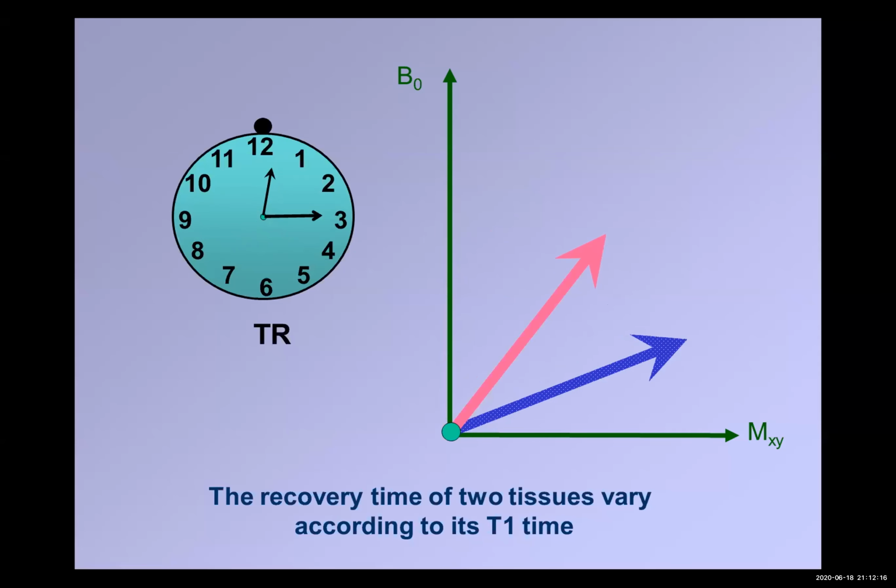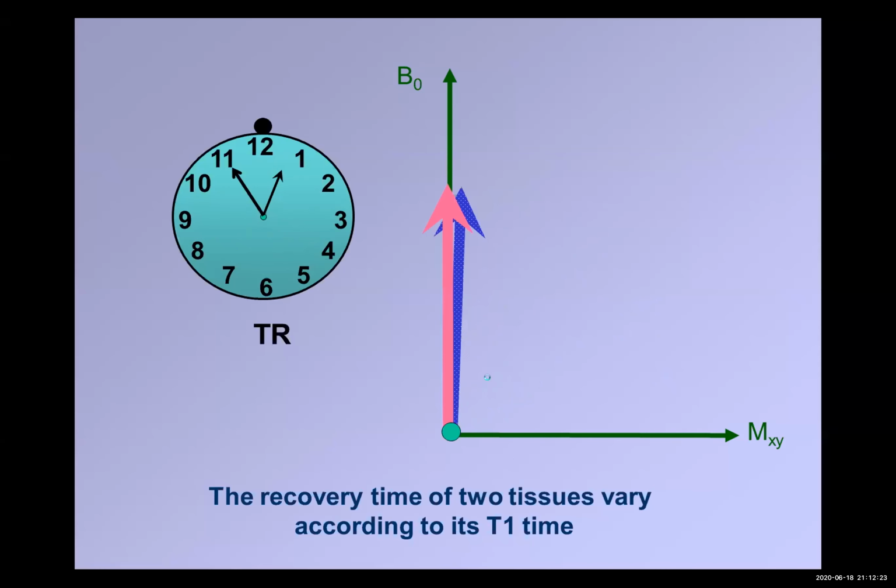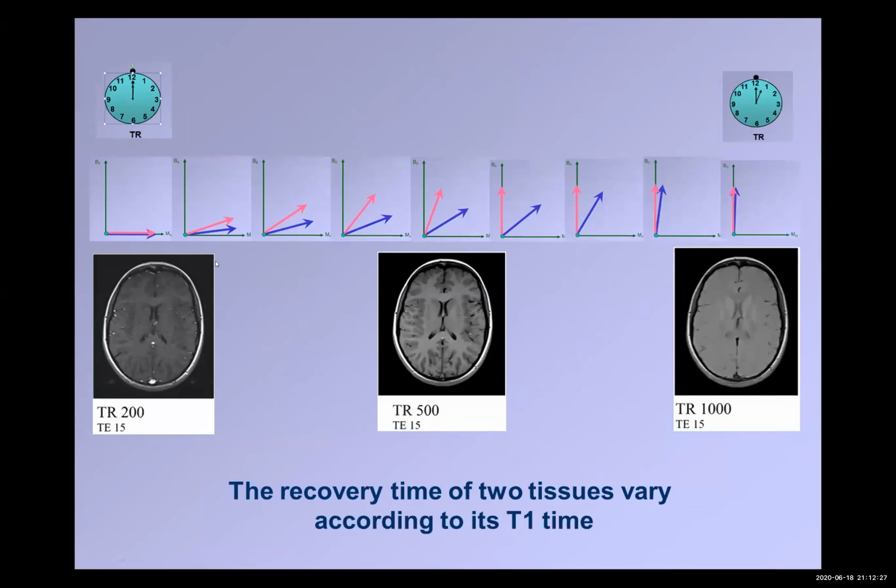So in this example, I need to select the maximum difference by selecting a short TR, not a very long TR, because this will allow them both to reach the end. And this can be seen in this diagram. So this is immediately after excitation. Still, there's no time for the protons to recover, and the image will usually be dark. Only vessels will be bright.